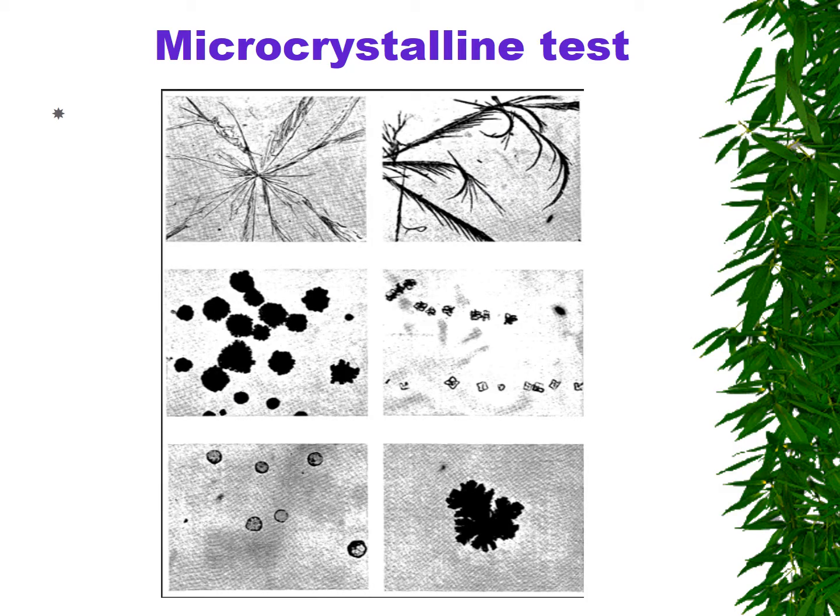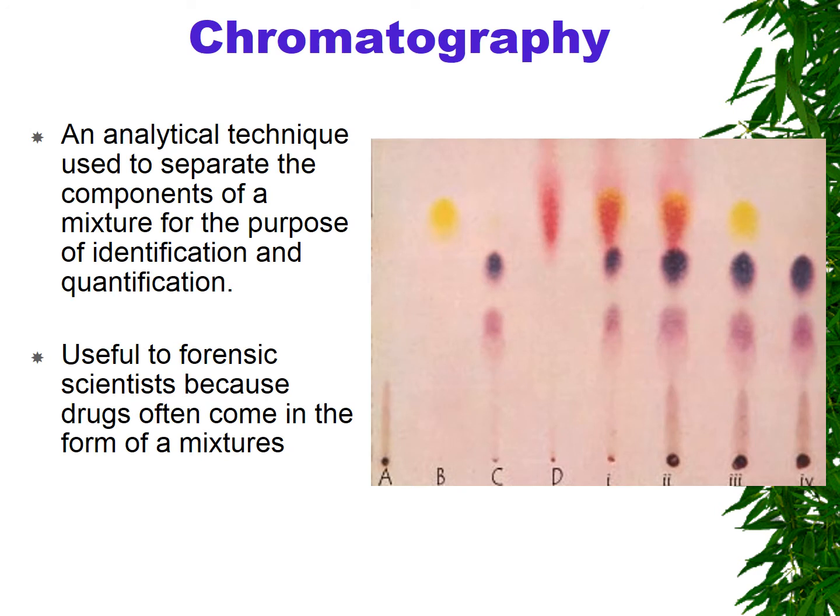Okay, this is an example of the crystal structure of the drug lah. Okay, the next one is chromatography, which is the first one for the confirmation test.